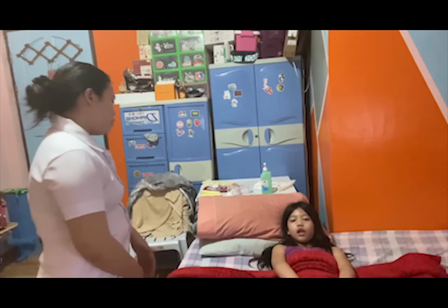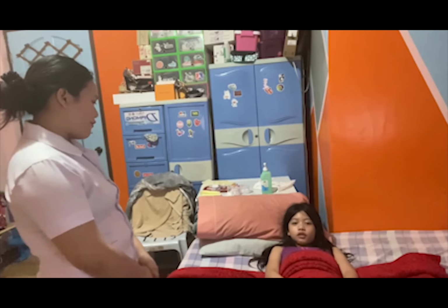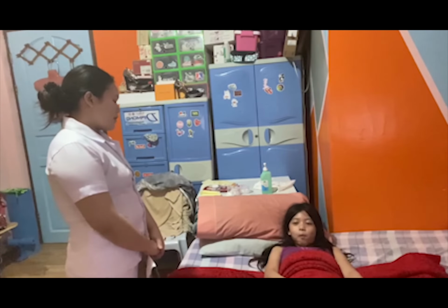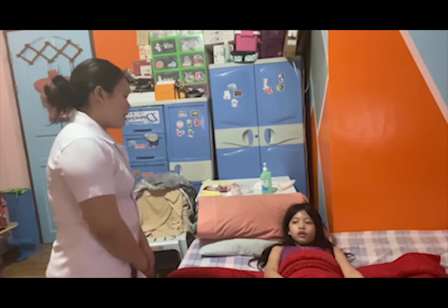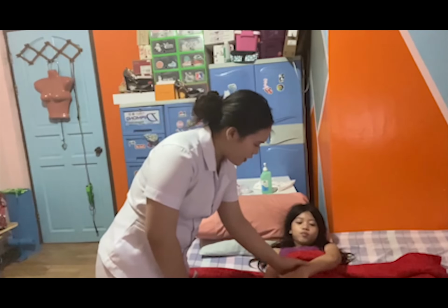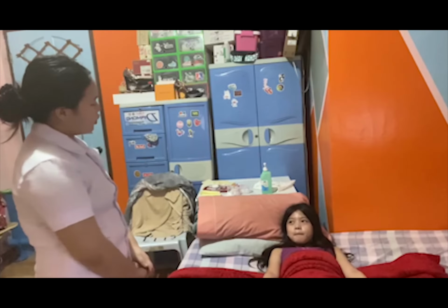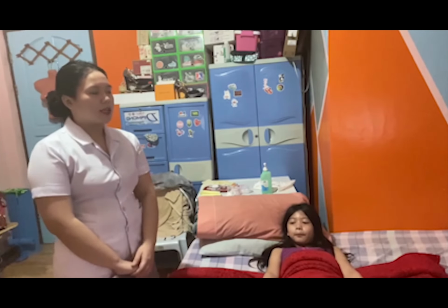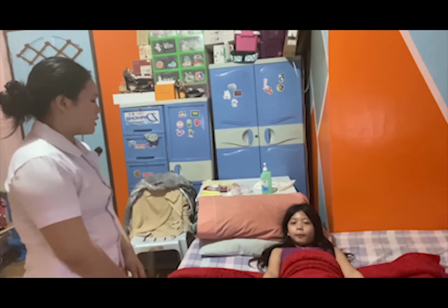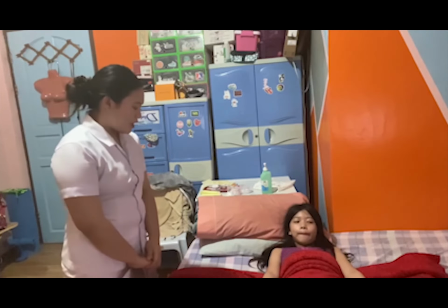So hello, I'm Christine Pen and I'm a student nurse from Davao Doctors College. So can I ask for your name, ma'am? So may I check your wristband to verify it? Okay, Miss Payton. So today I'm going to perform the intramuscular injection. So later on, I'm going to inject you with the medication that is needed.